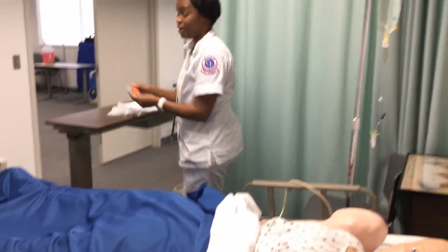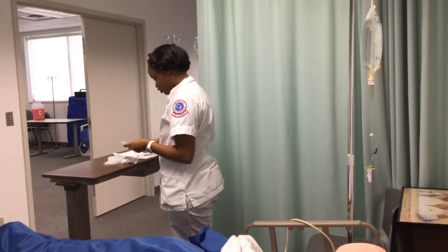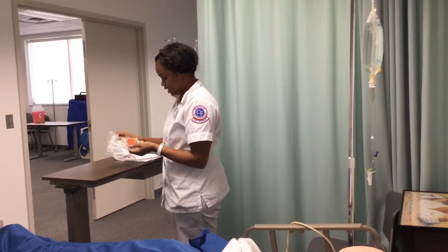Before I hang the medication, I'll do my third and last medication check. Gentamicin for Mrs. Jones. It is correct.